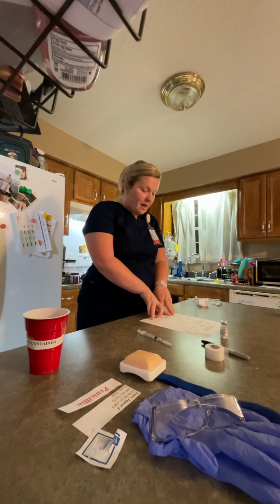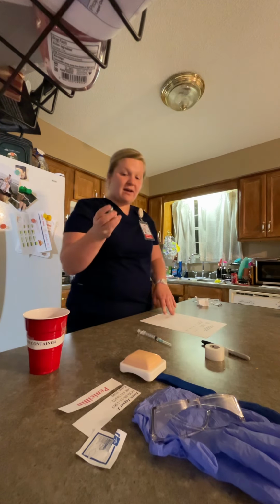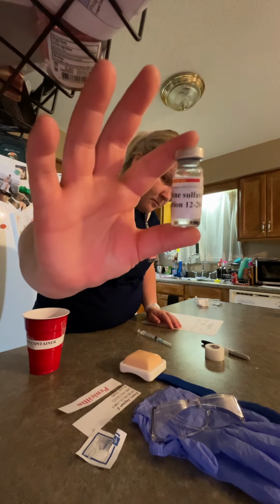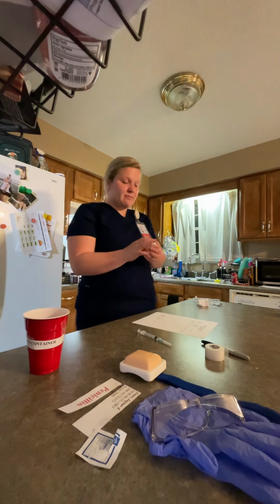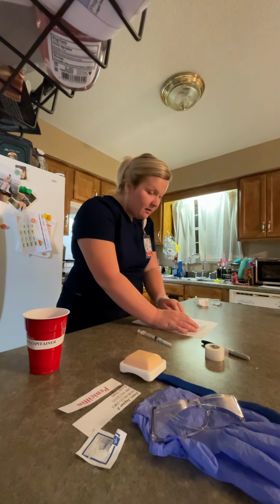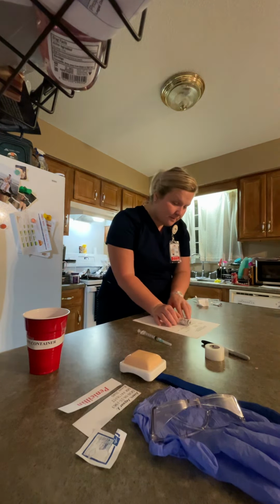I'm starting by saying the patient's name, Jaguar J. Jones. I'm taking my vial and I'm going to compare it to my MAR for my second check of rights. Morphine sulfate, 5 milligrams. This is a 10 milligram per milliliter bottle, so I'm going to do 0.5 milliliters.